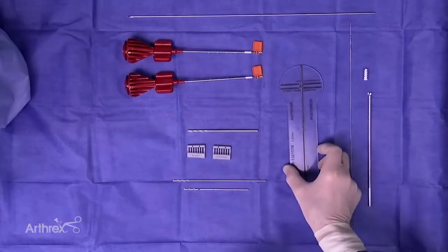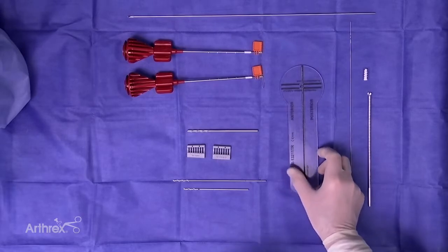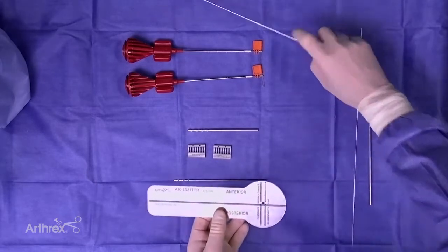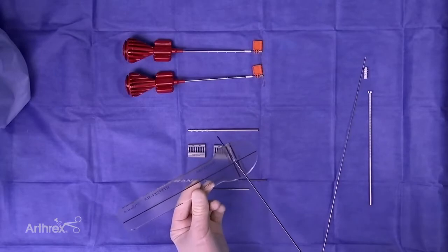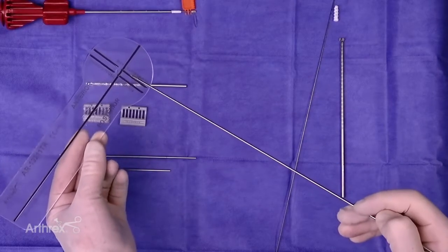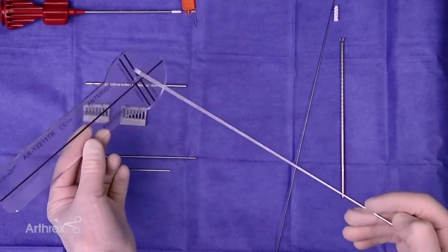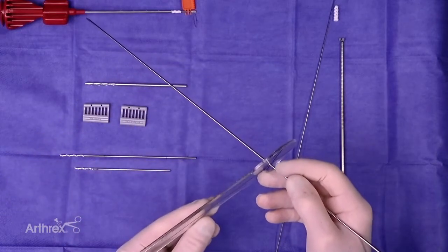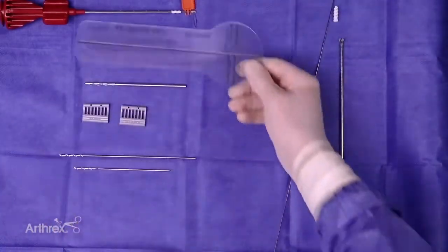In every case, I believe it's necessary to find your isometric point — so-called Shetley's point. This guide has been modified so that your passing pin goes actually through the hole. Once you get your optimal position at Shetley's point based on the alignment of the posterior femoral cortex, the two parallel lines between the upper aspect of Blumensatz and the medial femoral condyle on a true lateral, you find your spot, drill it, and slide the guide off with your pin in place. It's a one-step way to keep your isometric point on the femoral side.